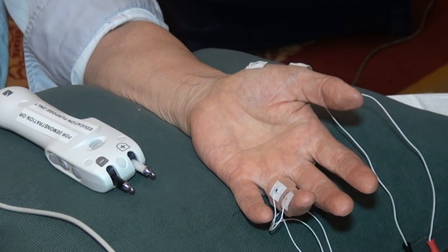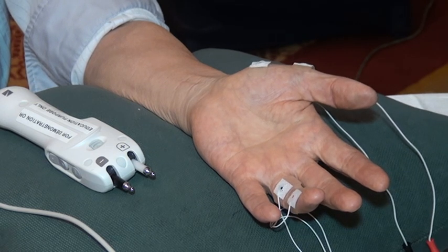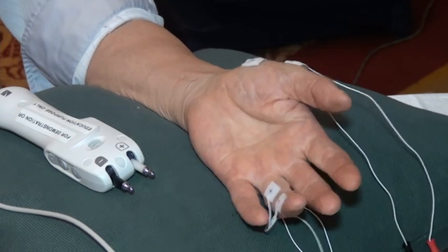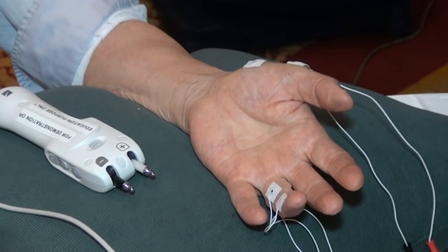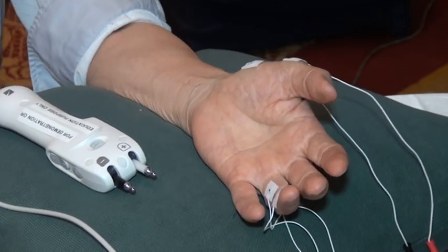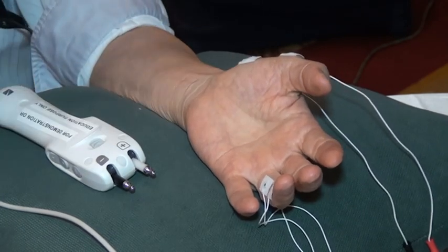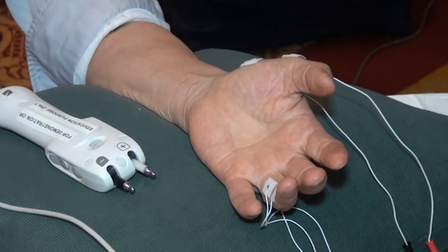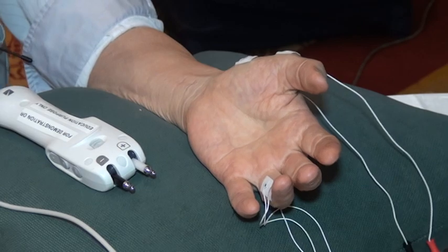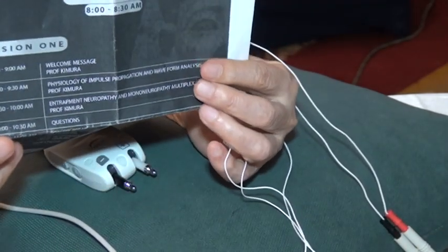You can see it in here. First one, usually you compare this to the third or fourth or fifth, and if there's a 10% change, it's abnormal. But this is not abnormal, right? Because it's me. I know my graph. So when you see this, you have to say this is technical. Now how can you say that? That is my question. How can you say that this is a technical problem without me telling you that it is technical?